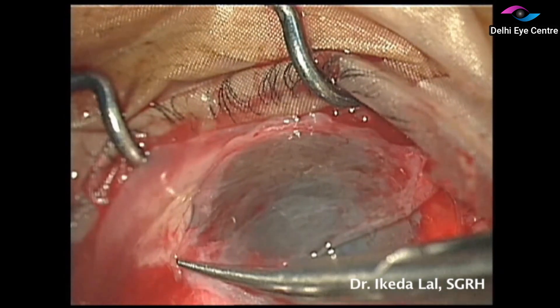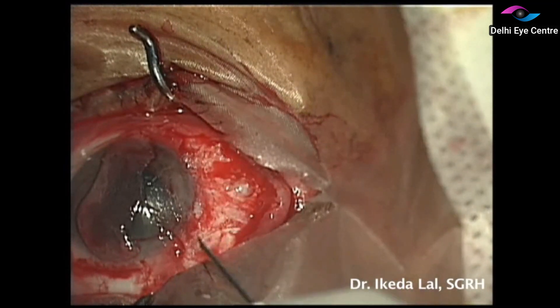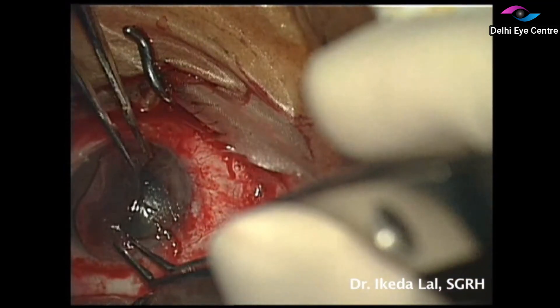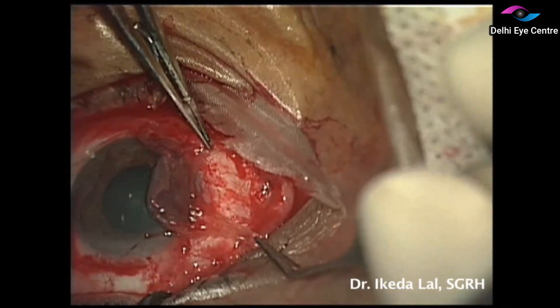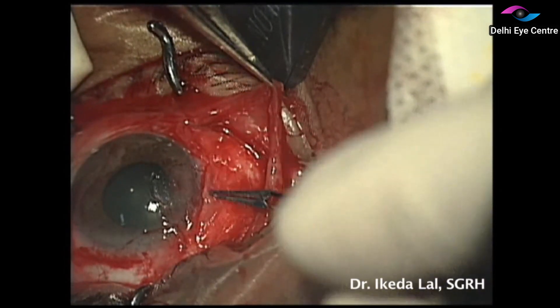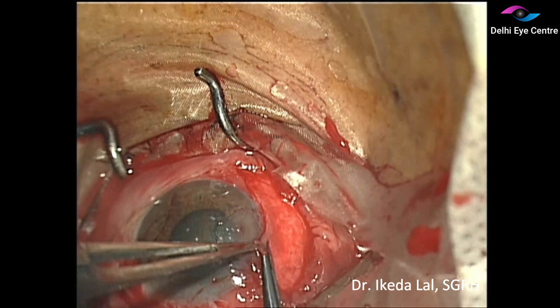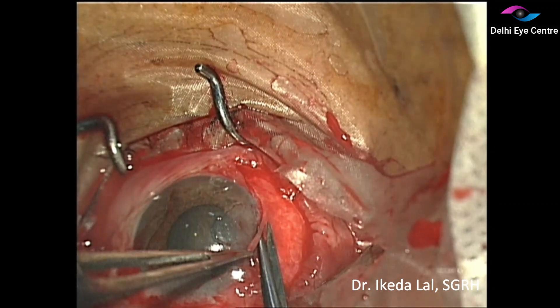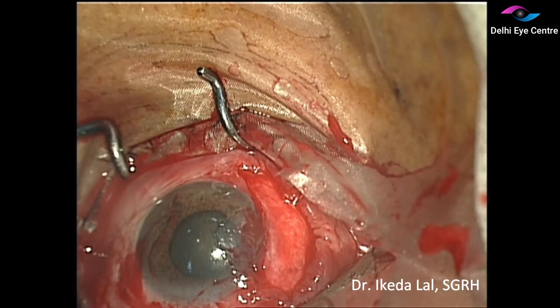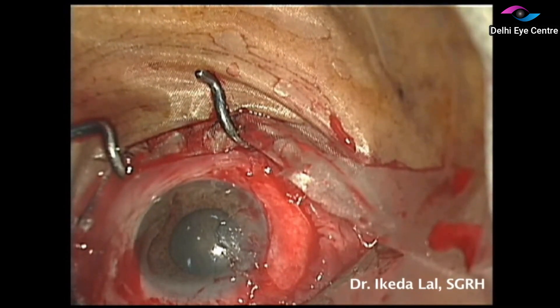We excise the graft and make sure it is secured in place using fibrin glue. This avoids the need for suturing and the patient feels more comfortable after the surgery. The graft is secured in place and the excess tissue is trimmed off to achieve a good cosmetic outcome. At the end of surgery, we inject subconjunctival steroid as well as antibiotic and then patch the eye.